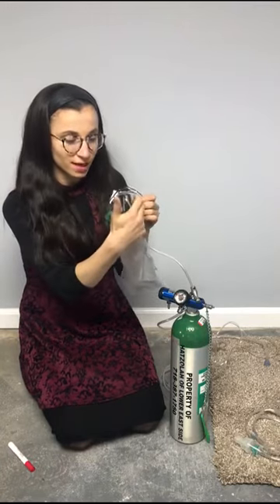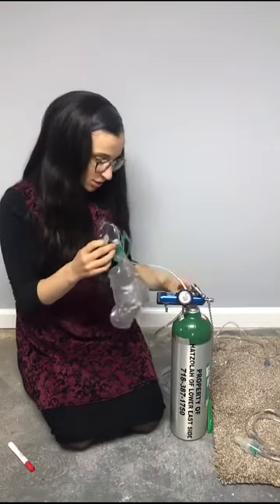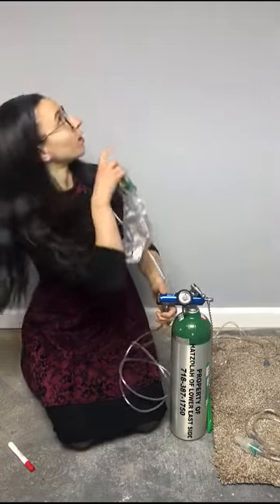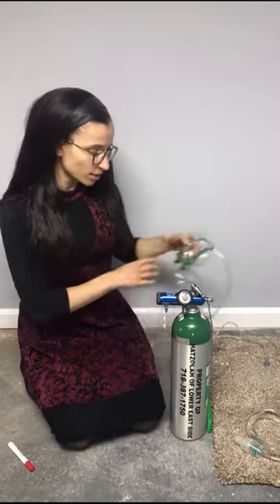So air is not coming in from outside. This bag's going to go like this. It's going to go around their head. You're going to attach it just like you attached the other one. It will come with this, attached to the tree. And you're going to put it up on 10 to 15 liters per minute. So those are the masks.